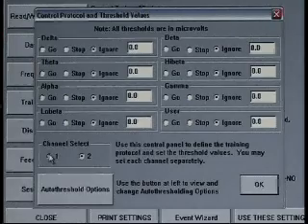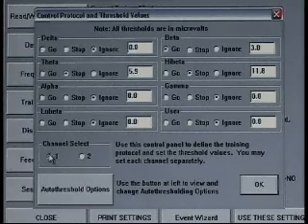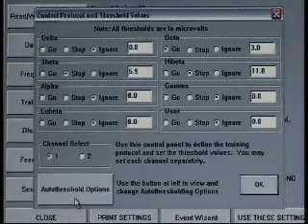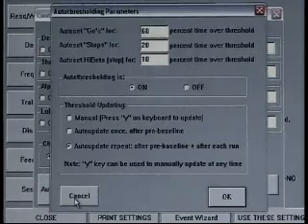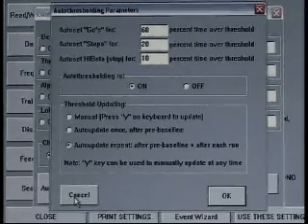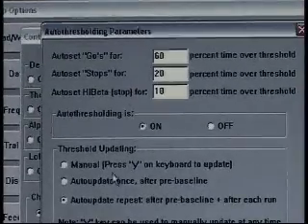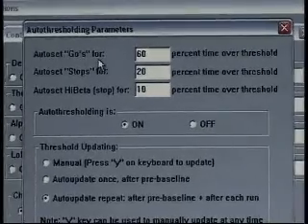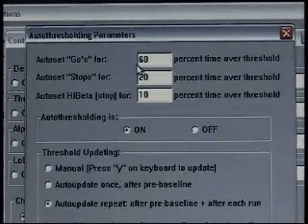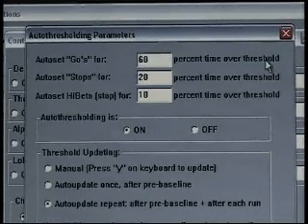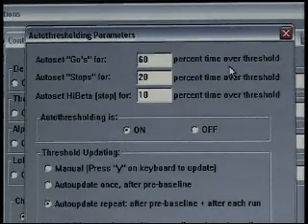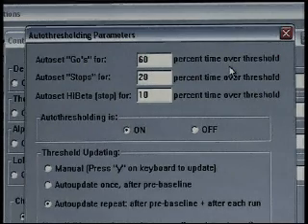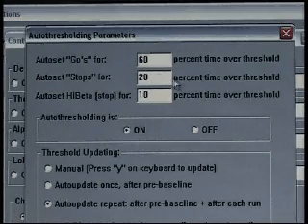Our next option is to click the auto threshold options button. As I click this, we get yet another control box, and under this control box there's several decisions to be made. Starting up at the top, you notice our auto set goes or our rewards, and the definition's very important here. It's 60% time over threshold. That means that the goal is for the client to be above their threshold 60% of the time. We only want them to fall out of criteria no more than 40%.